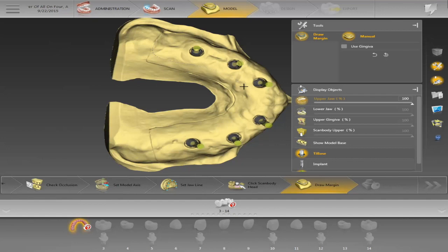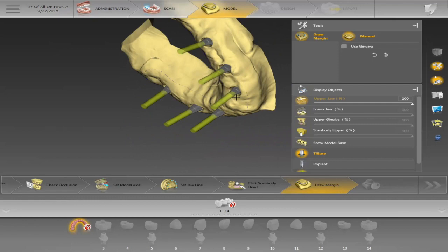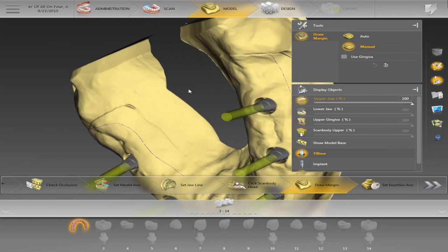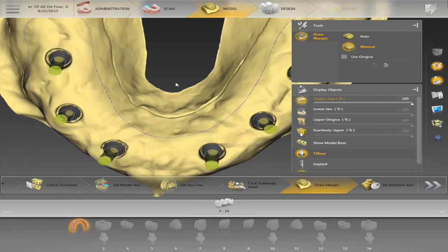Now I'll pick my margin — this is for the gingiva. When I click on the margin I can place it wherever I want. Normally I just drop down a line so it pops up, because I'm not always sure where the teeth will be, especially if I'm not copying a denture or scanning in a bite block. I can always edit the gingiva a little later, but for now I'm just going through the process of designing these cases. Now we'll go to the edit insertion axis.